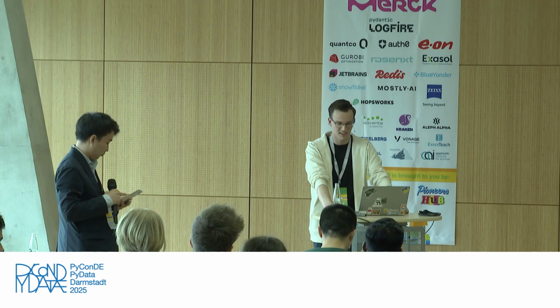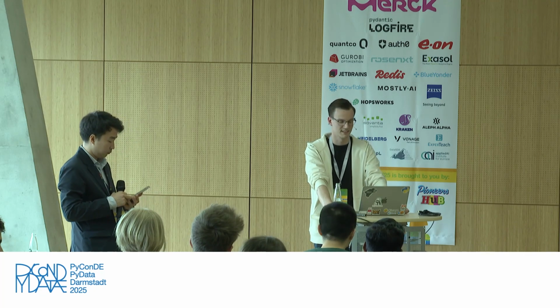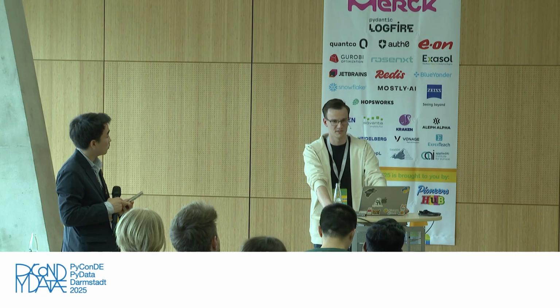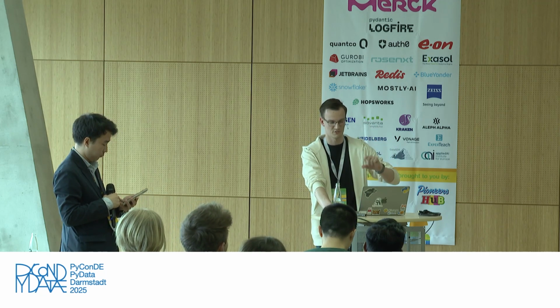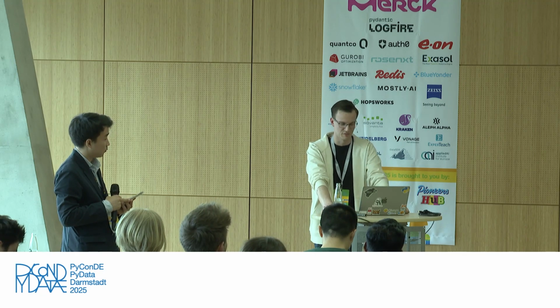And as soon as you have created your data set, you can apply the auto machine learning code to it, and it runs without any problem. With nnU-Net, it's even enough to just generate a test, train, and validation folder and have your masks and images in them, and it works. Another framework is a bit more complex, but the pre-processing part definitely isn't handled at all.